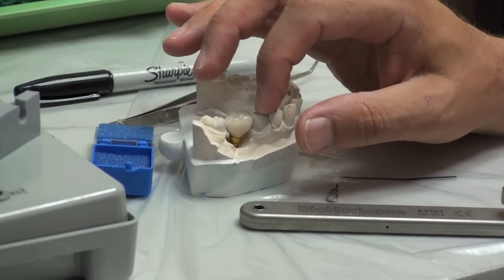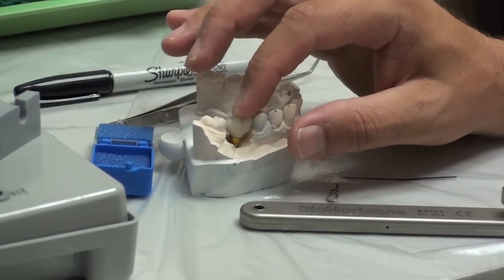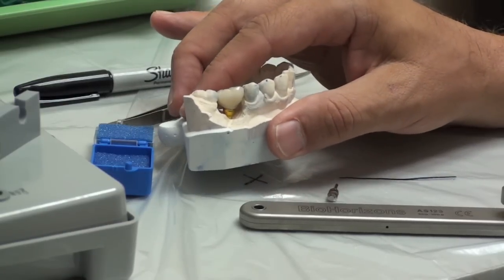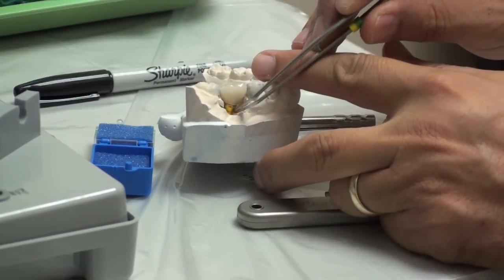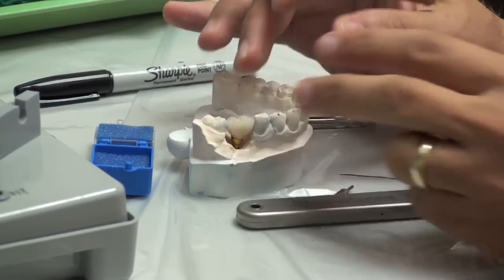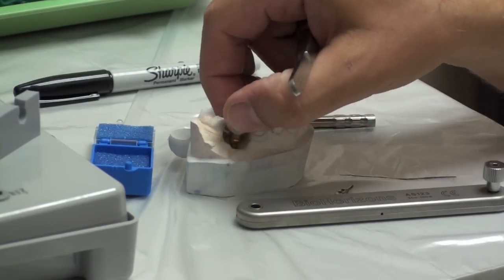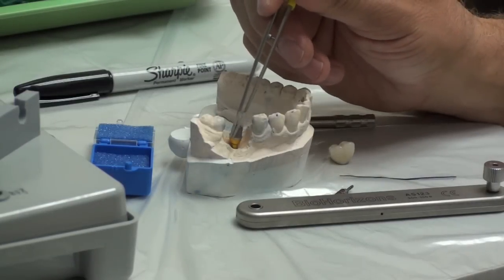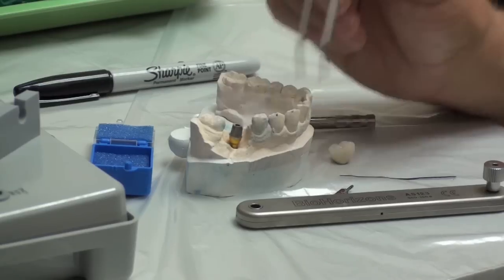So you adjust your contacts, feel the contacts are okay. Before you adjust the top of the crown, take a new x-ray and verify that the junction between the crown and the abutment are tight. If they're not tight, there could be something holding it up - it could be the contacts or it could be the tissue. We don't have the model of the tissue here, but the tissue could have grown and swollen and just be different from what the laboratory had to work with.